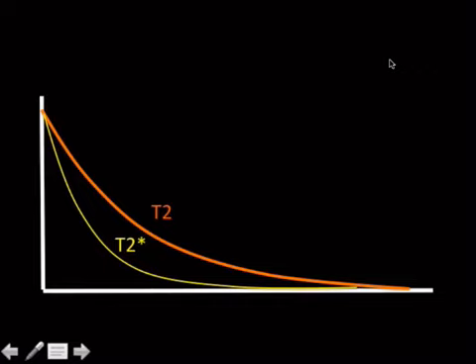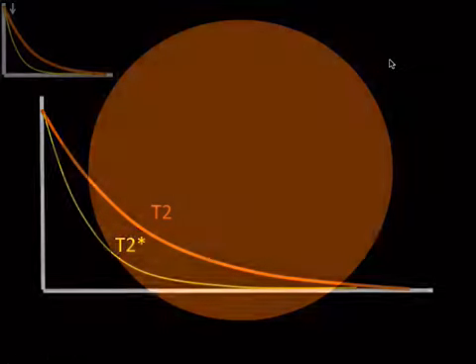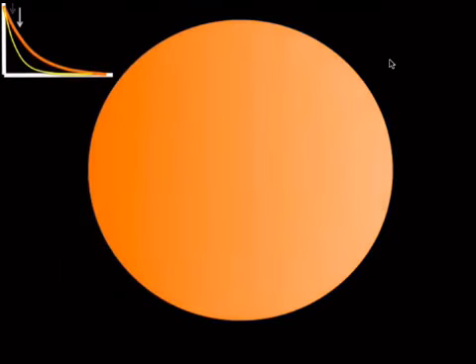So things that would make this worse would be metal, air, think about anything that blooms, like a magnet inside of a magnet. And that's causing the field to become distorted or inhomogeneous. That's your T2 star, okay? And that gets worse over time. It becomes more noticeable.